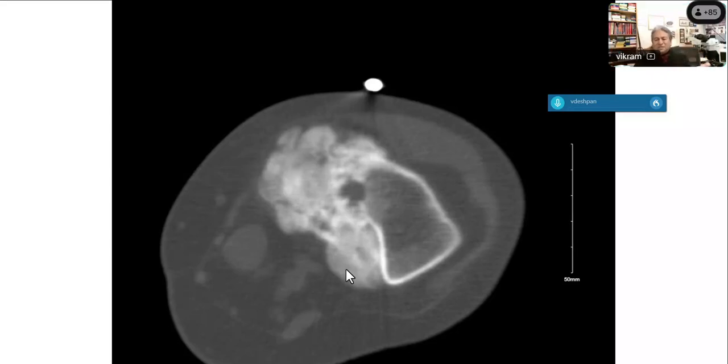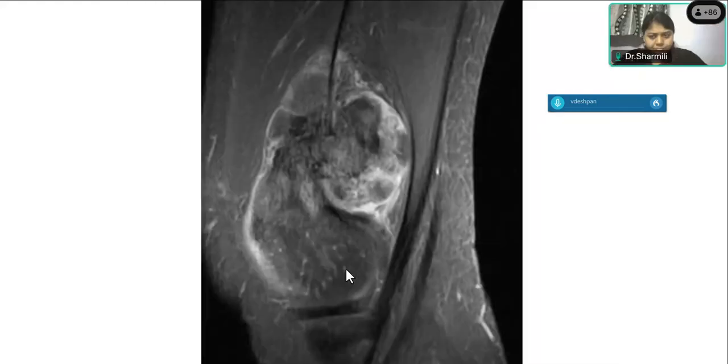In fact, it turns out to be a pretty classic phenotype of a bone-forming tumor. Here's, I believe, the T1 image. There's something going on in the marrow. Much of that could be edema, but I think what is most prominent is this big mass on the posterior surface of the femur, right?